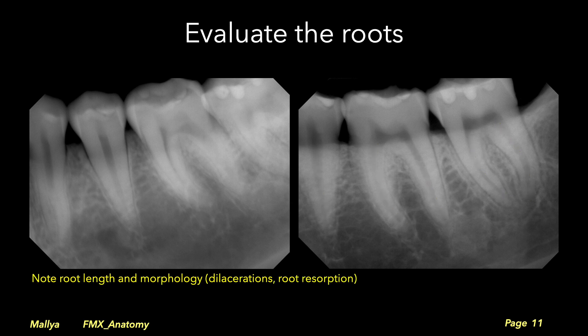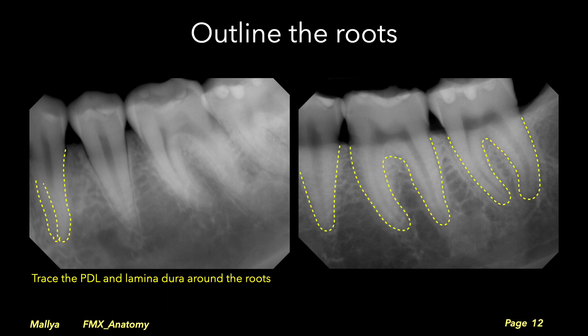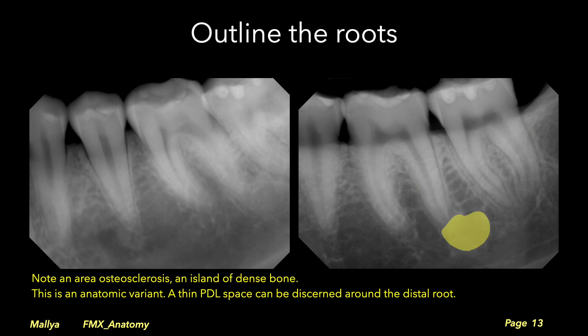Evaluate the roots, assessing the root length, the crown-root ratio, and noting any dilacerations in the root. Note that the region of the furcation is better visualized on mandibular molars than it is on maxillary molars. Trace the laminar dura and periodontal ligament space along the length of the roots.